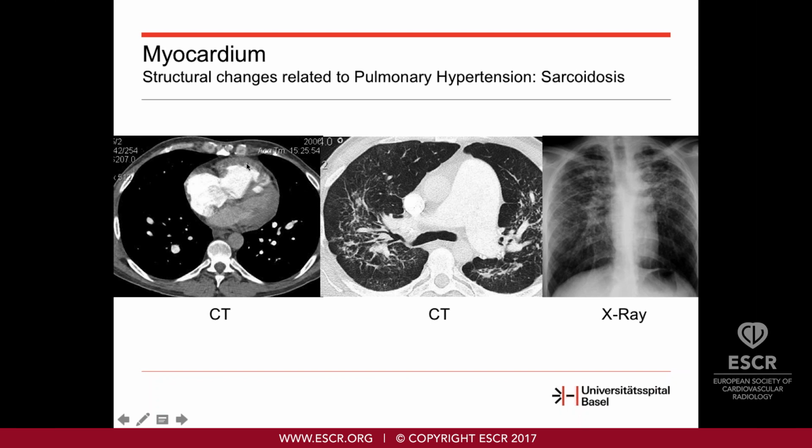However, it has only a limited sensitivity for further analysis of the myocardium. But it's very helpful to identify, for example, calcifications, as we are using for the calcium score.